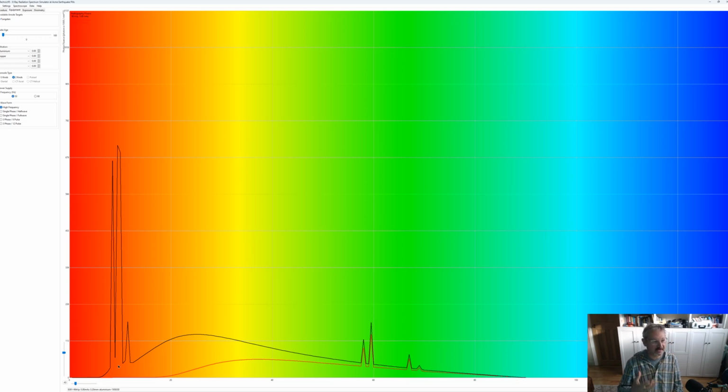And so this is potentially harmful radiation, which shouldn't be anywhere near a patient. And so we put filtration in to remove these characteristics, and as we add the aluminium filtration, you can see a very small amount of aluminium filtration will take these spikes out completely.